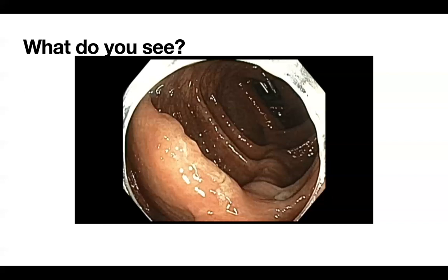During that large polyp resection, your focus is on that one, so the rest of the colon screening may or may not happen at the time. That is something that needs to be kept at the back of the mind all the time. We may successfully manage this first polyp, but we might still not be doing a good job of screening the rest of the colon if we are not keeping that as a focus and at the back of our minds.